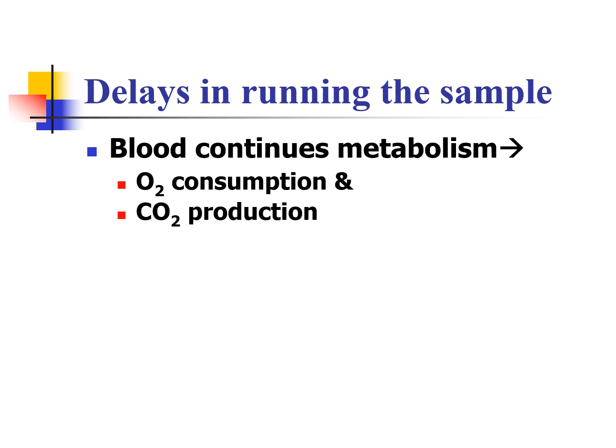If we don't have the ability to put it right away into the blood gas machine, we usually have to put it in an ice bath to take it over there to stop or to slow down blood metabolism. That way we get an accurate view of both their PO2 as well as their CO2. So we get an accurate value of both of those.